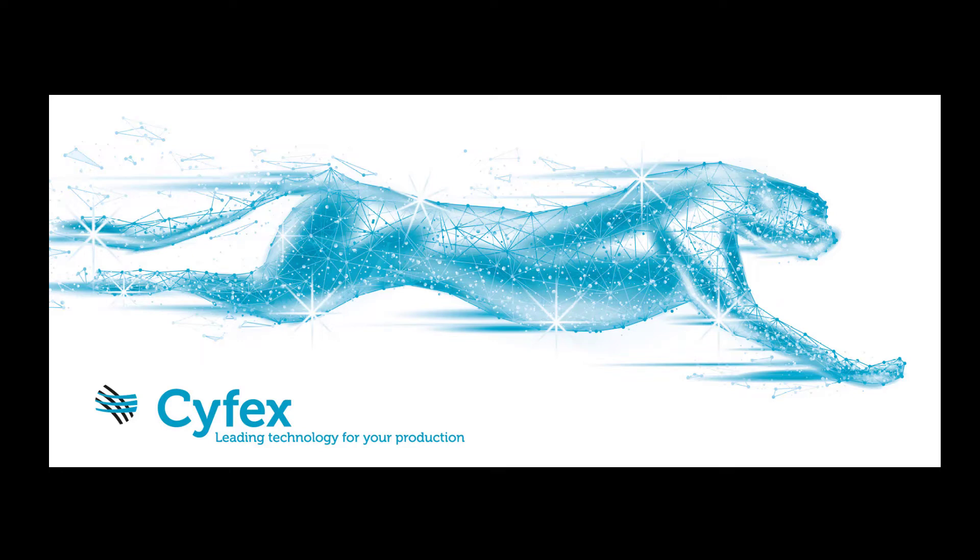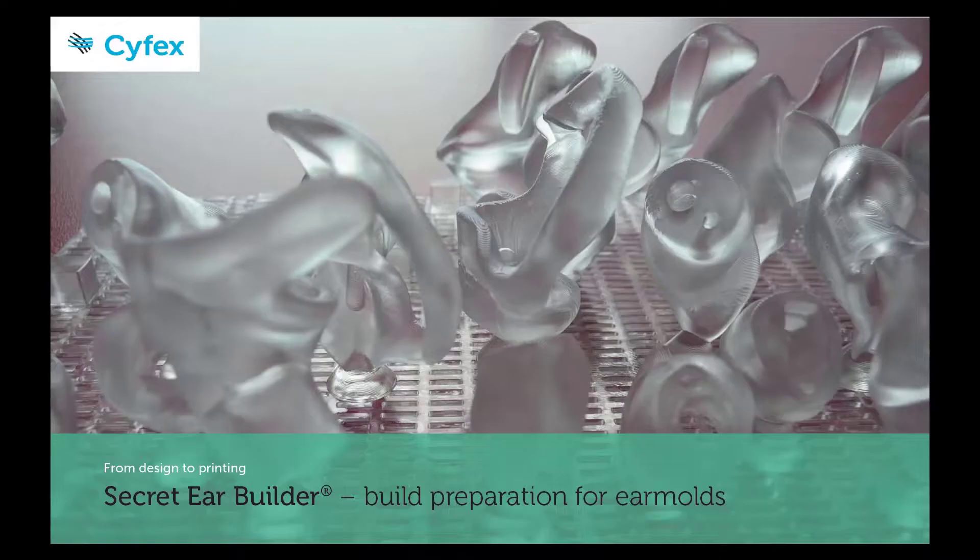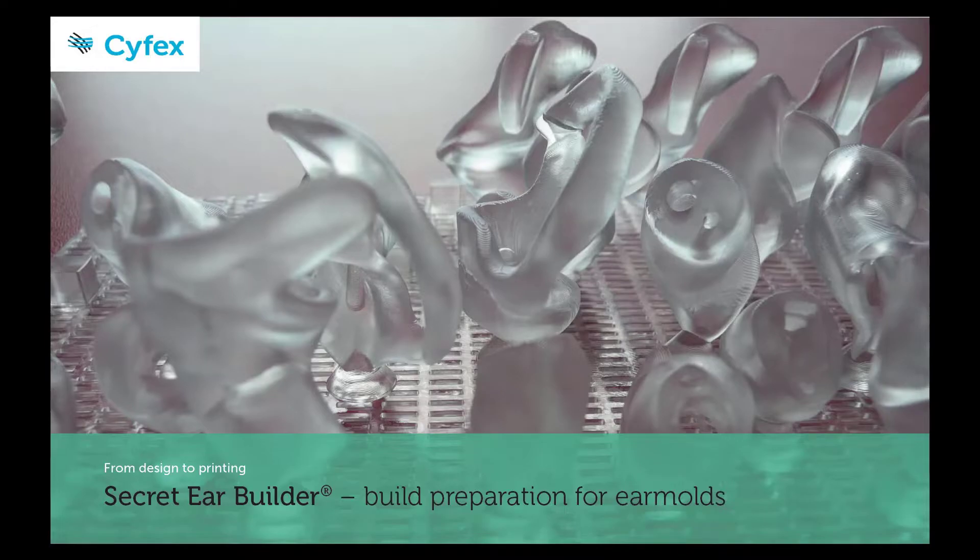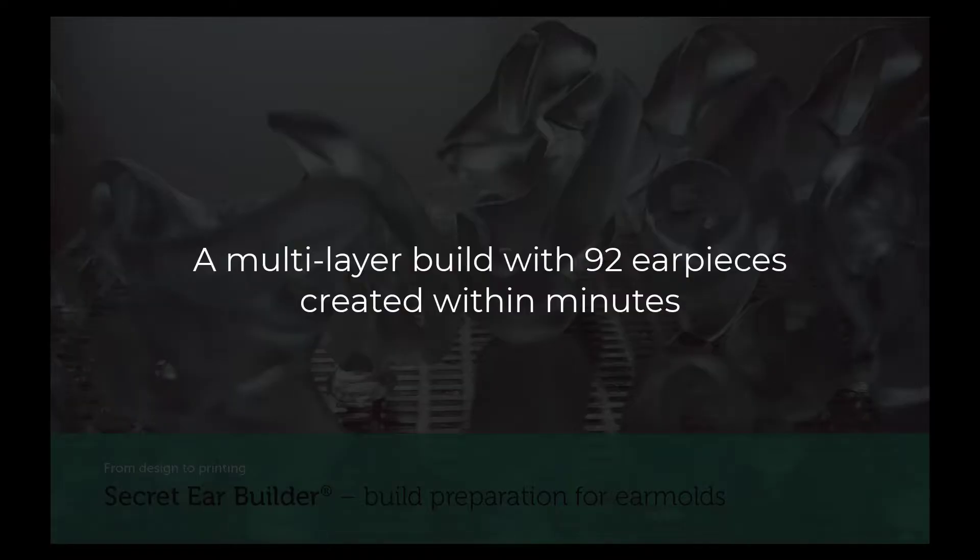Cyfex - leading technology for your production. Secret Ear Builder: build preparation for ear molds. A multi-layer build with 92 ear pieces created within minutes.